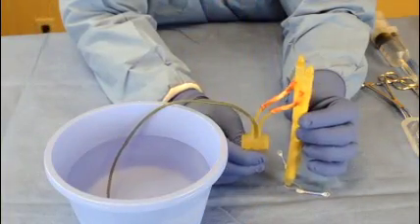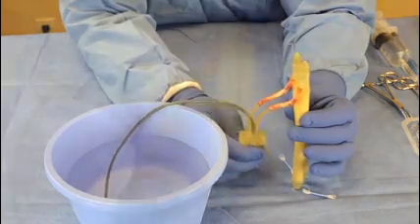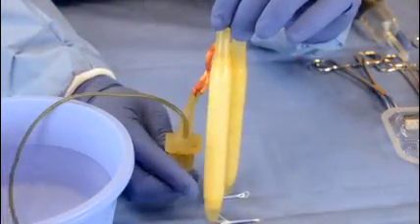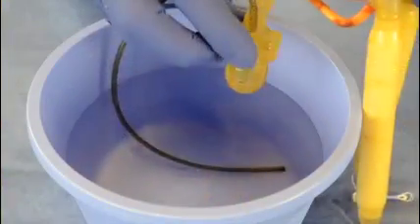Following the initial squeeze, continue to squeeze and release the pump bulb until the cylinders are rounded and the pump bulb is harder to squeeze. Let the pump bulb completely refill between each squeeze.